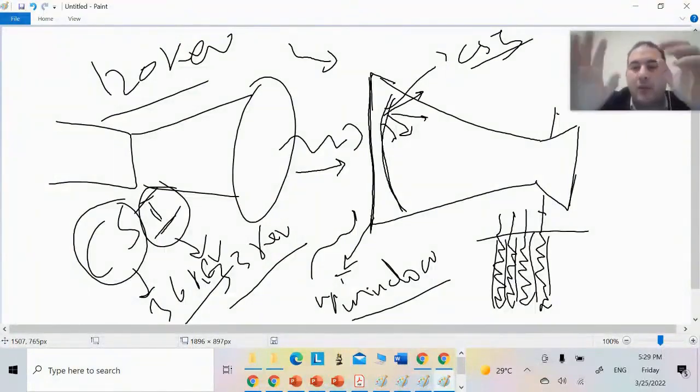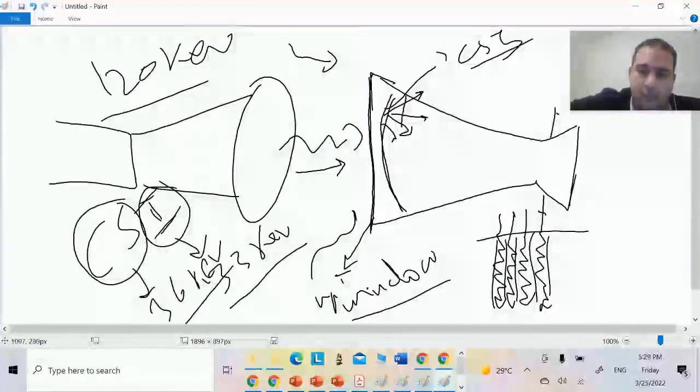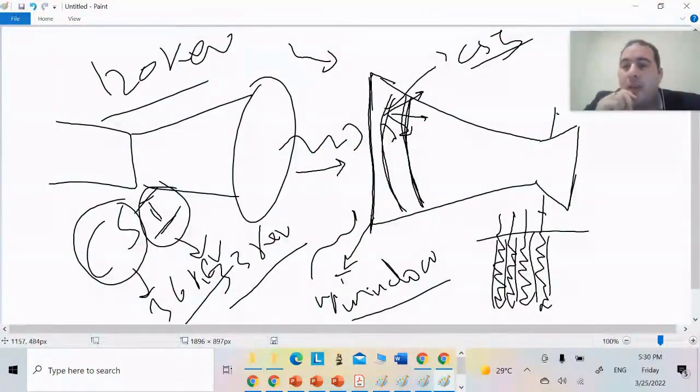So that's it. We've dealt with the issue of what will happen as a result of choosing the right type. Great, now take this. He said, no, what you just mentioned is still not enough for us. So what should we do? He said, all right, you will take these and add another material. So what he calls cesium antimonide here receives the incoming light photon and converts it into an electron.